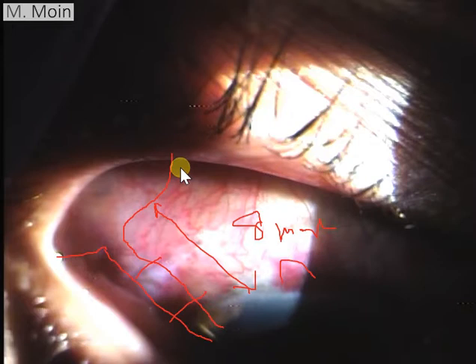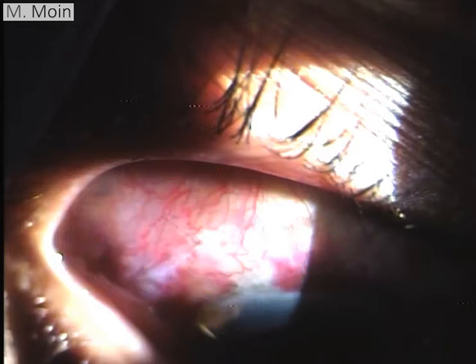But in this area, you see an elevated area, and when you're putting this tube in, it's usually very important and sometimes very difficult to get that placed in the right area. In this area, you can see these are the anterior ciliary blood vessels which are coming over here. If I clear this area, it's important to find out that these are the anterior ciliary blood vessels coming from the superior rectus, and here you will see anterior ciliary blood vessels coming from the lateral rectus.